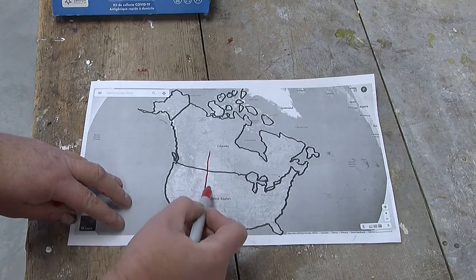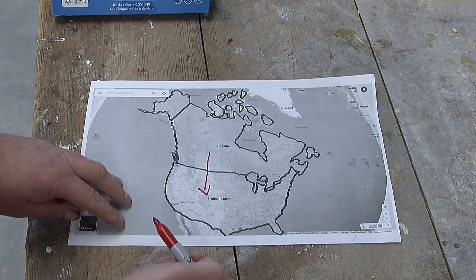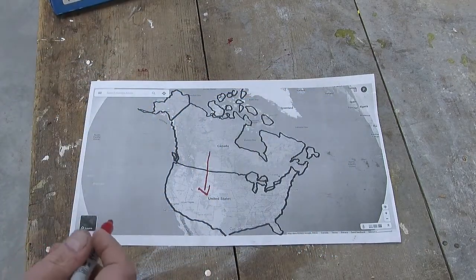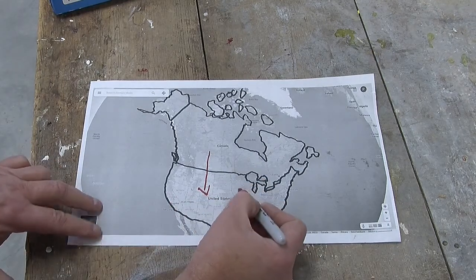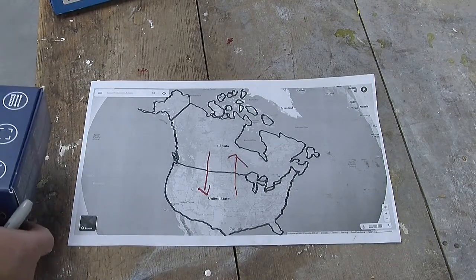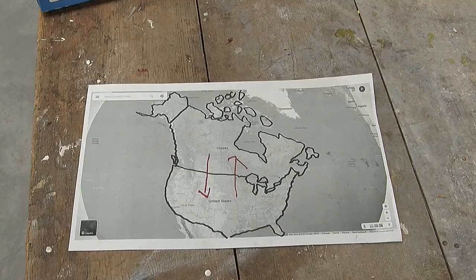Going from north to south, you need a rapid antigen test, something like this one over here, and you need to take it the day before you travel. Coming back in this direction, you need a more elaborate test, some sort of an amplification test, and the one I used was an RT-LAMP test.